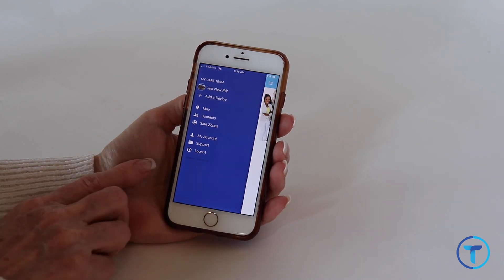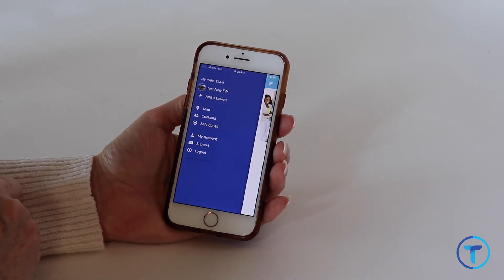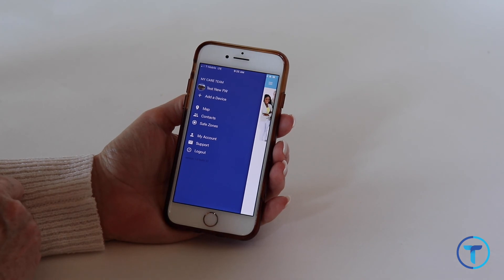Note that to receive notifications you must be logged into your app. If things aren't refreshing or working, try logging out and back on.